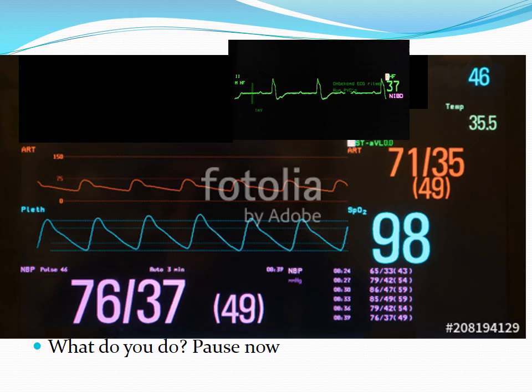You are carrying out an emergency laparotomy for bowel perforation on the same patient, which you elected to do without transvenous pacing wires as the patient is septic and there's no one in your regional hospital that can perform them. Midway through the open surgery, you see this on the monitoring screen. What do you do?